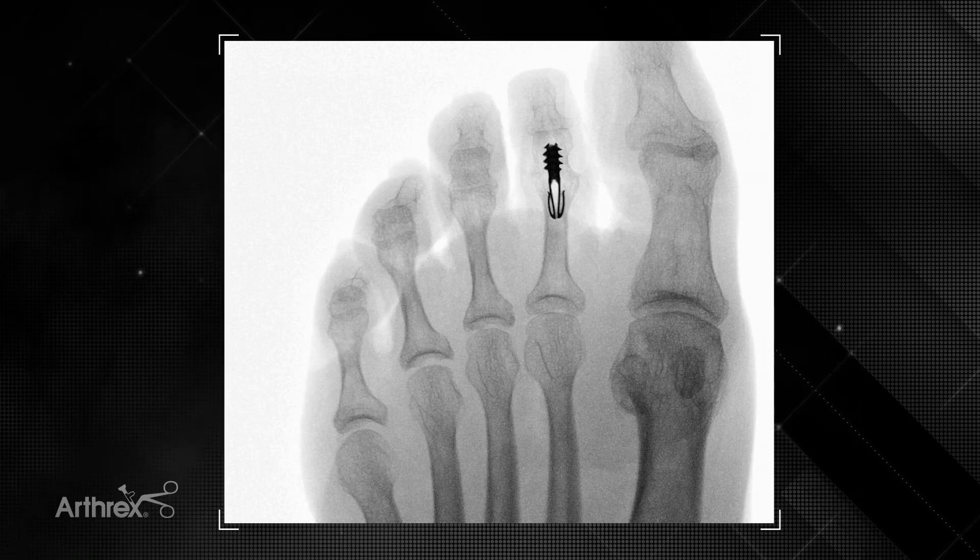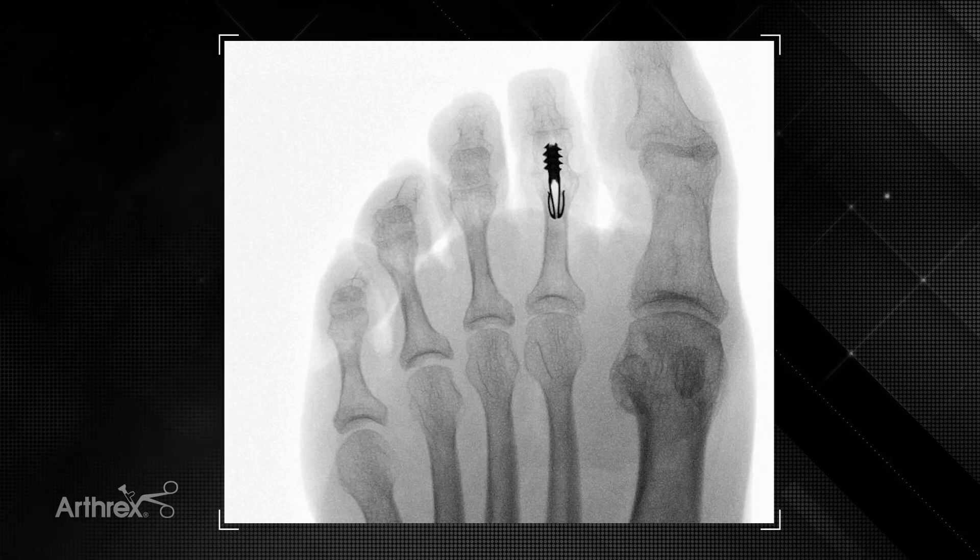We'll go ahead and allow immediate weight-bearing in a post-operative shoe, and after about four to six weeks, once I see bony consolidation across the fusion site, we'll go ahead and advance back to regular shoes as tolerated.